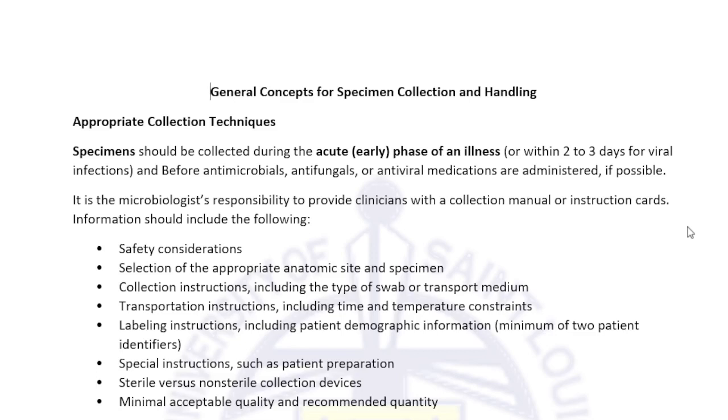Specimen should be collected during the acute early phase of illness, within 2 to 3 days for viral infection, and before antimicrobials or medication are given. Why is this so? So that we will be able to grow the bacteria. Remember, this is bacteriology. We are more of cultivation.